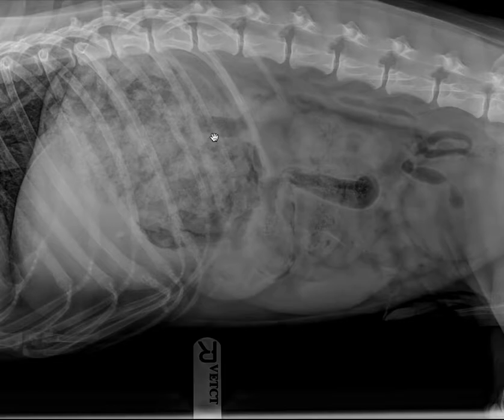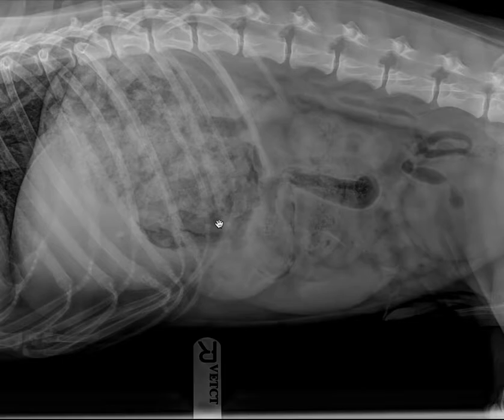The second possibility is that there's delayed gastric emptying of the ingesta. Delayed gastric emptying can happen for functional and mechanical reasons. Lastly, maybe this isn't normal ingesta but in fact is foreign material. Some foreign material can have this type of opacity.